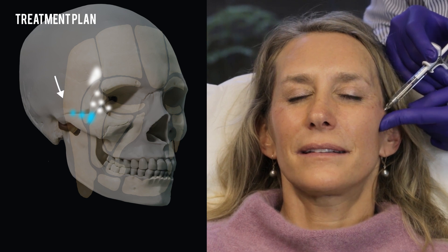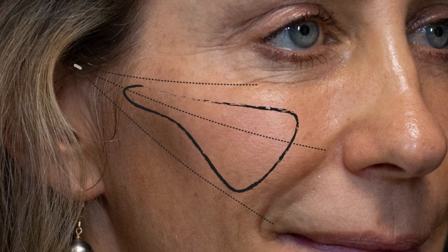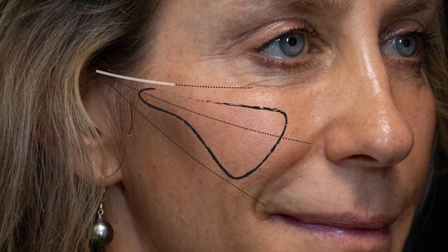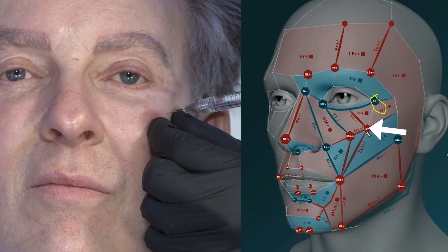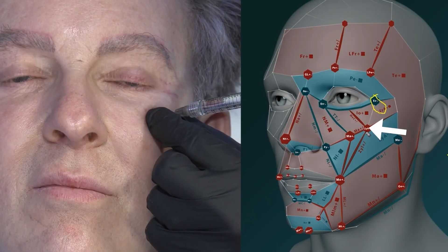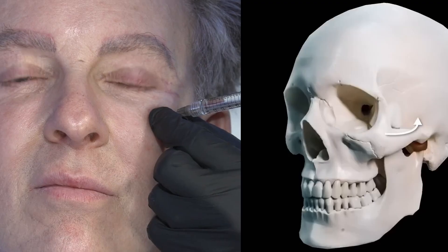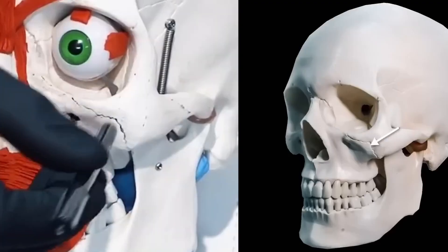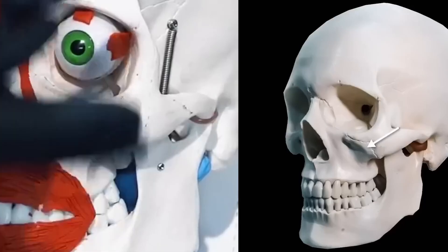When treating cheeks, something really useful is to think about the surfaces of the zygoma and the direction in which they face. If you project outwards from any surface, you're going to get a different result. Looking at this male cheek, which is often a bit strong but relatively smaller compared to the rest of the face, there's a slight upward tilt on the superior aspect of the zygoma and an anterior-facing element. If you inject here, you project the cheek anteriorly.